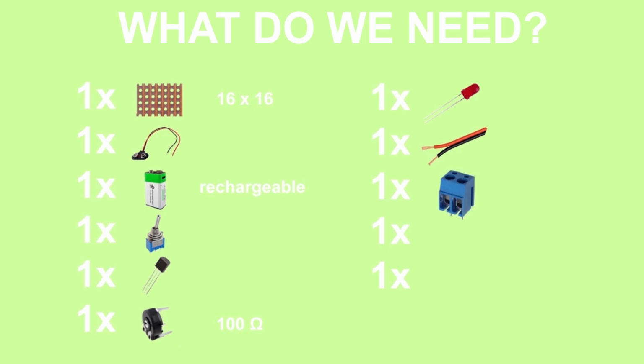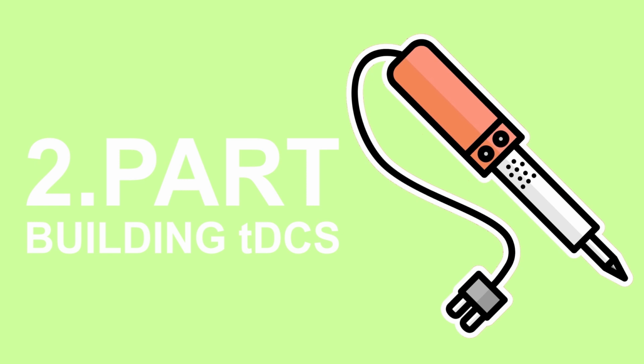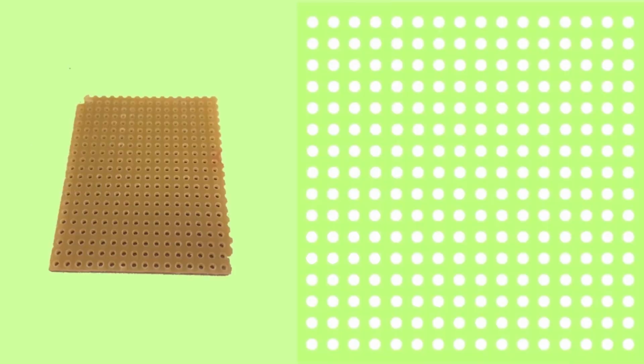Two cables that are connected to the output. And then two resistors. One resistor is 33 ohms, all the way to 39 ohms, it doesn't matter. And the other one is a 470k ohm resistor. Now we will assemble the tDCS.